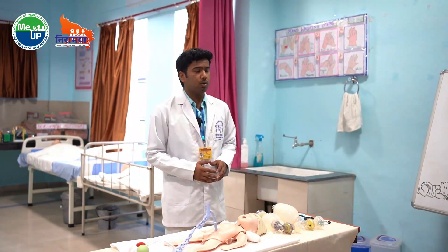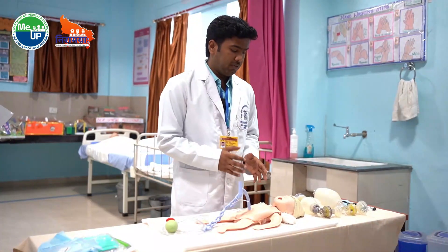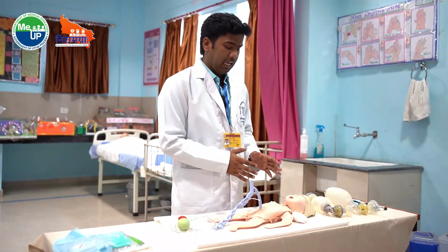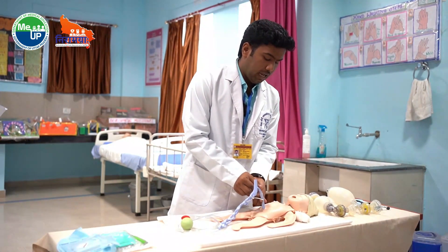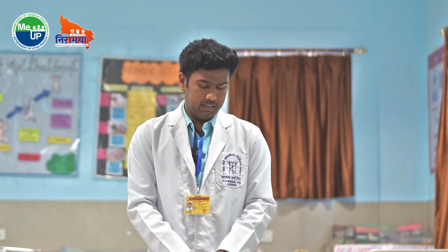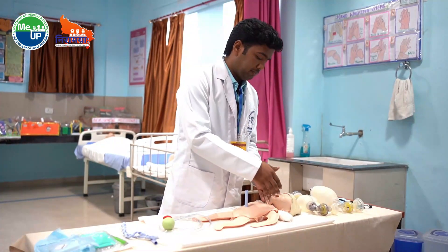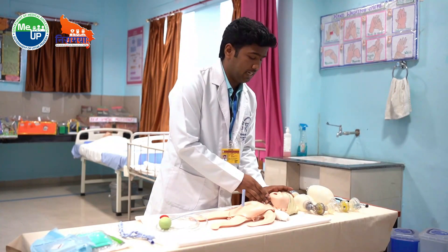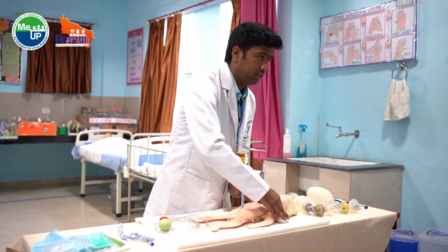Now I will show you neonatal resuscitation. Just after the delivery of the baby, we will check whether the baby is breathing well or not. If it is not breathing well, immediately clamp the cord and cut it, then transfer the baby under the radiant warmer. After transferring the baby, we will position the baby such that the head and chin is extended, with the help of a shoulder roller.